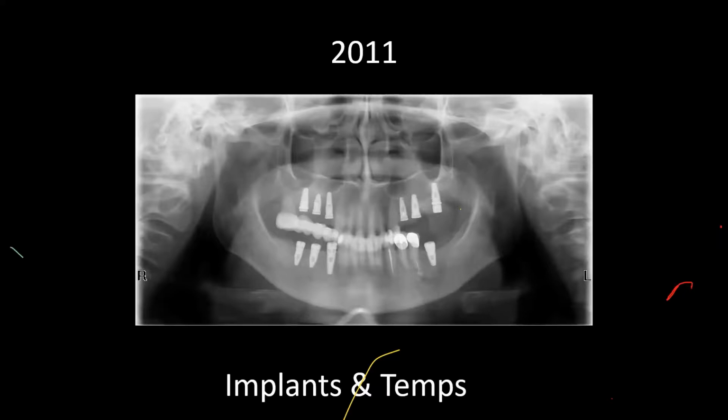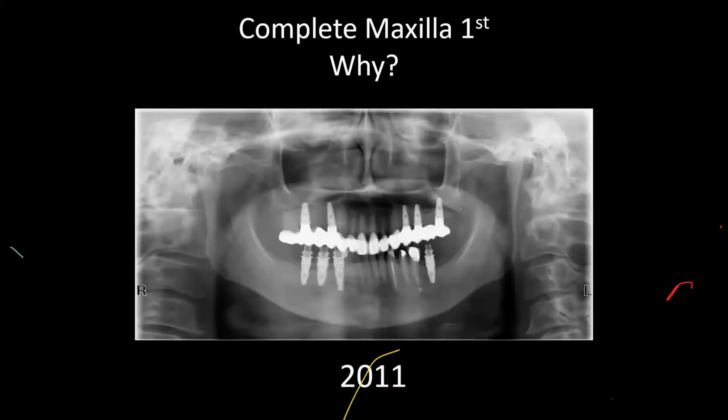And again, you can see that I restore the maxilla first, because that establishes my occlusal plane. In a lot of dental schools, they're taught to restore the mandibular plane first. I disagree with that, because I decide where the smile line is and then decide which way the mandibular plane will go. It's more accurate, and aesthetics is an important part of driving the restorative outcome. That's how I like to look at it.